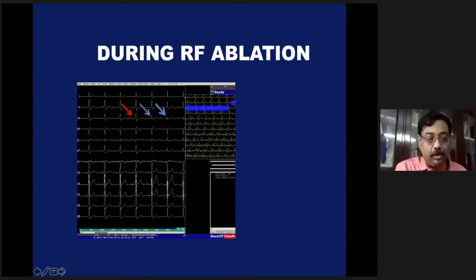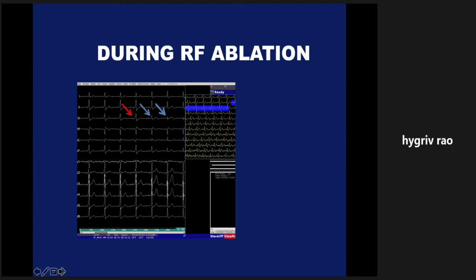This is a very important diagnosis. So you can see from where we have come to where you made a diagnosis of wide irregular tachycardia, cardioverted, found pre-excitation, and actually ablated and cured the patient for life.